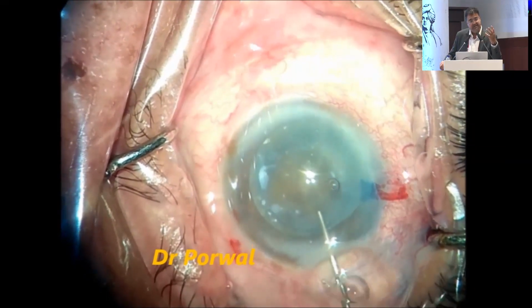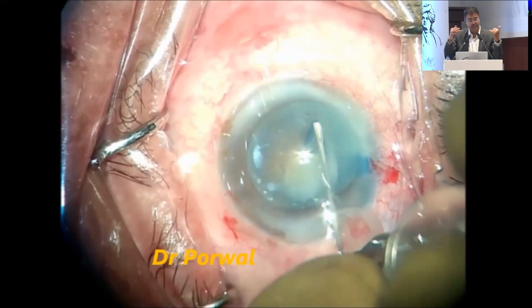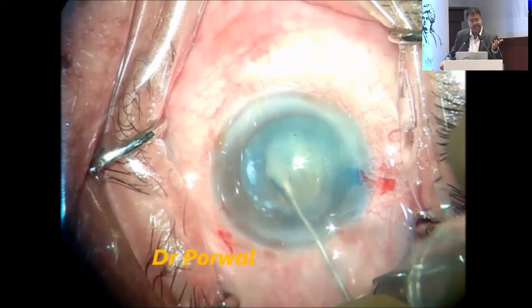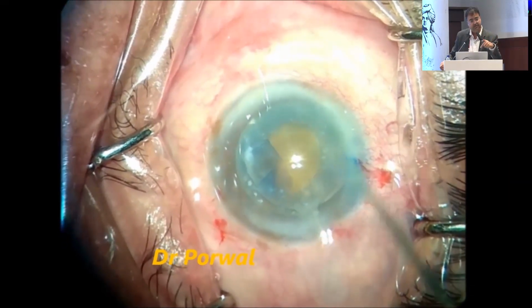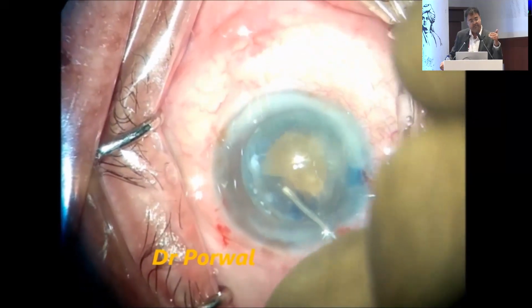So everything has come out, and now you see there is a nucleus, there is a bag, but there's no support anywhere else. So now when you do rhexis in this type of cataract, what happens is the support of the nucleus below the capsular flap is not there. So what you can do is you can put the cohesive visco into the bag also, because that will give you some resistance. See what I'm doing? I'm putting it inside the bag also, because that will give some resistance, and I'm doing the rhexis.